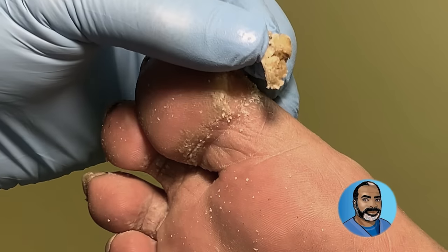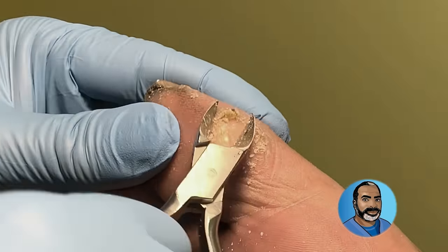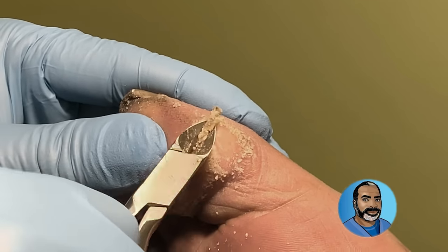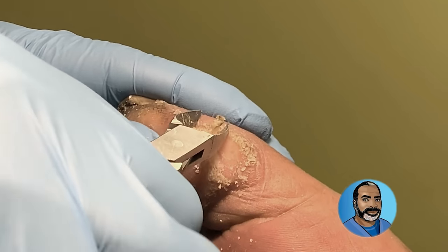Now that the center is removed, you can see how thick it is. Can you imagine walking on this every day? I also had to remove some more with the tissue nippers around the edges because I didn't want to take the chance of injuring the patient with the blade trying to remove this.